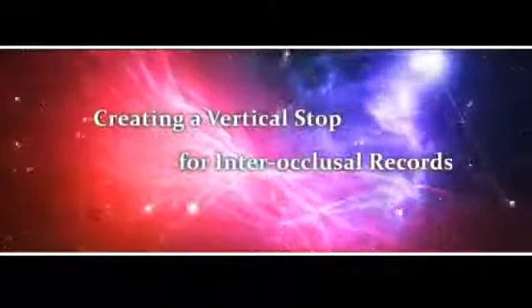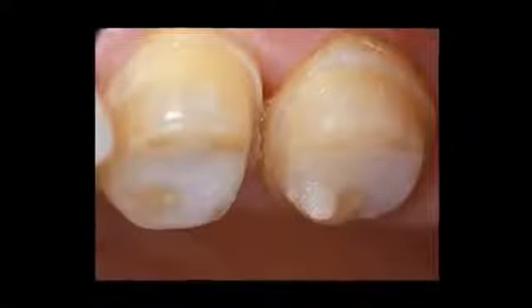Creating a vertical stop for interocclusal records. Flowable composite resin can be used as an accurate interocclusal record for the orientation of models for fixed prosthetic restoration.